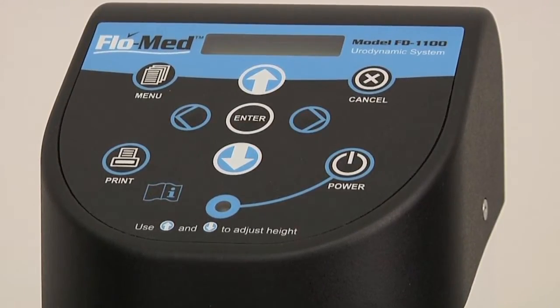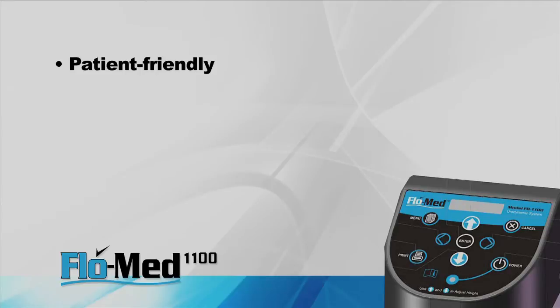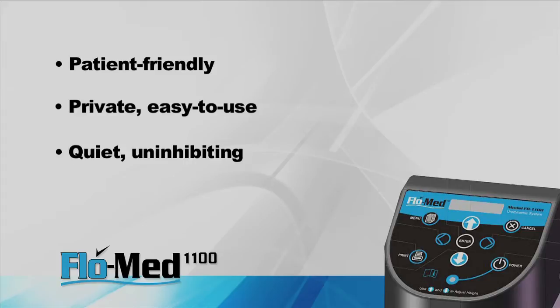The FlowMed 1100 is also patient-friendly. The patient can use it in complete privacy without the help of a technician. It was also designed to have minimal noise associated with the measurement so as not to inhibit the patient.